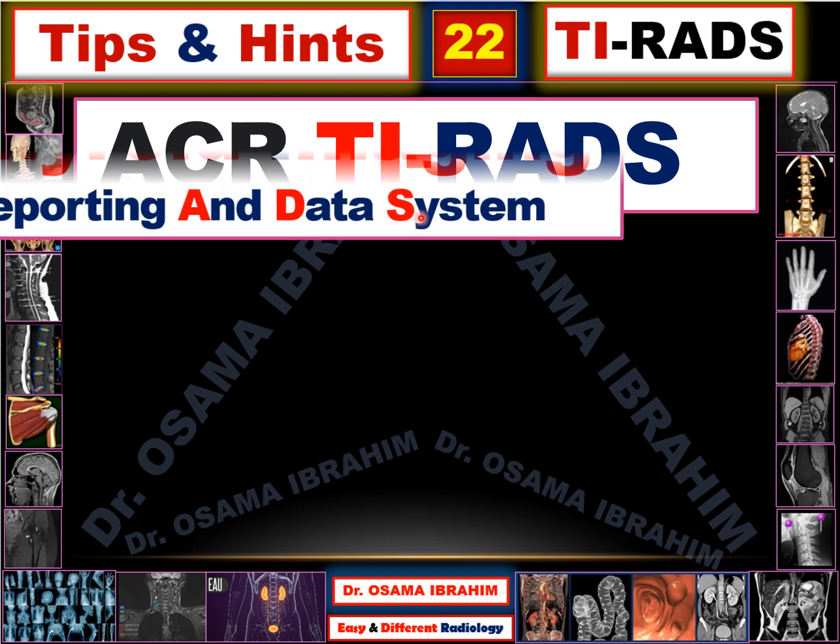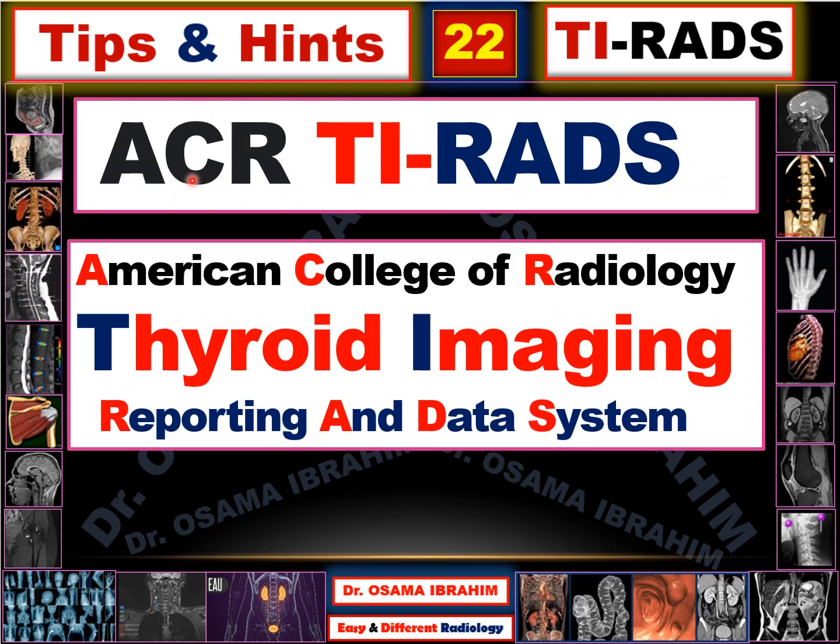First of all, what is the definition of ACR TI-RADS? ACR is the American College of Radiology. TI is from thyroid imaging, RADS is reporting and data system. So ACR TI-RADS represents American College of Radiology Thyroid Imaging Reporting and Data System.